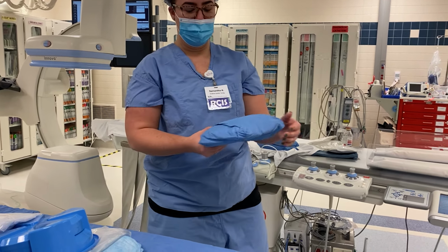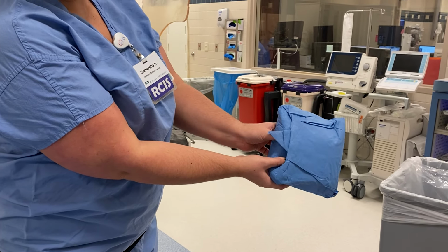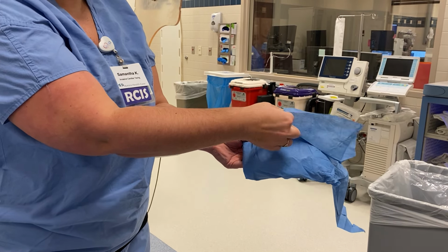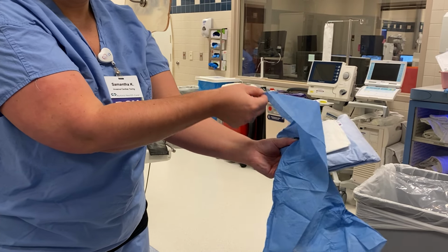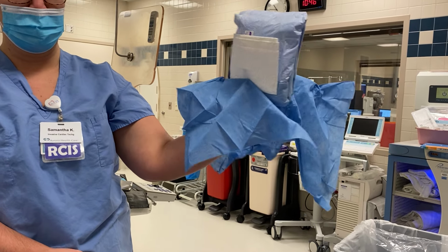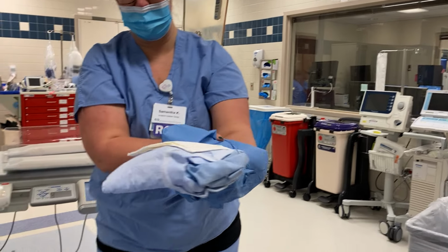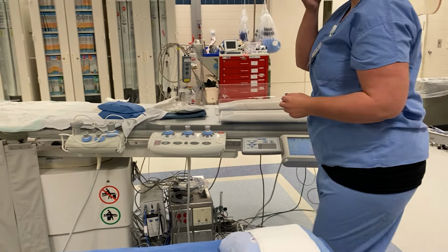Next, we're gonna open our 3 gowns. So in the packaging, I'm gonna stick my thumb right underneath the flap here and pull this first away from me, and then pull these 2 out to the side. So everything on the outside of the packaging is now considered dirty. Everything on the inside is sterile. But I'm going to gather all of this up, and then I can set this right down onto the table. And I'm going to do that for all 3 gowns.